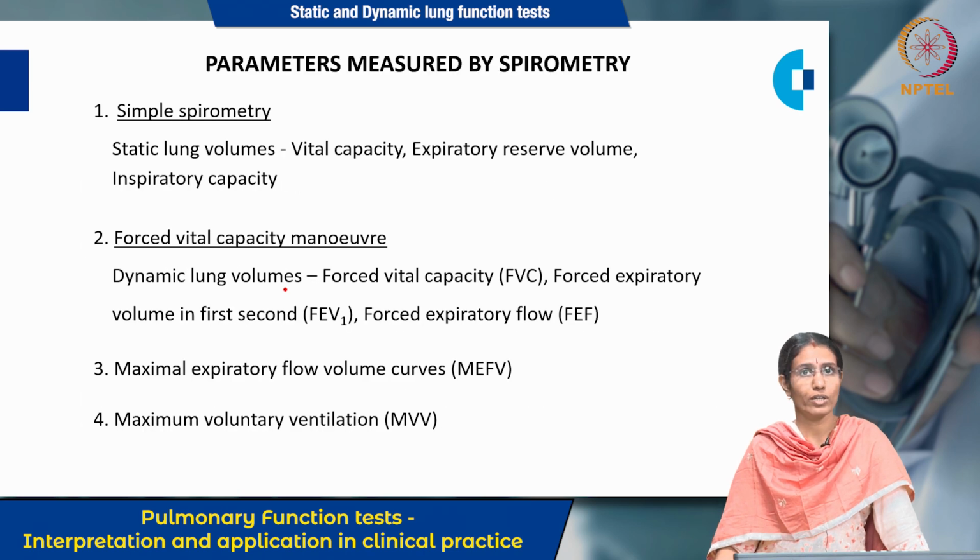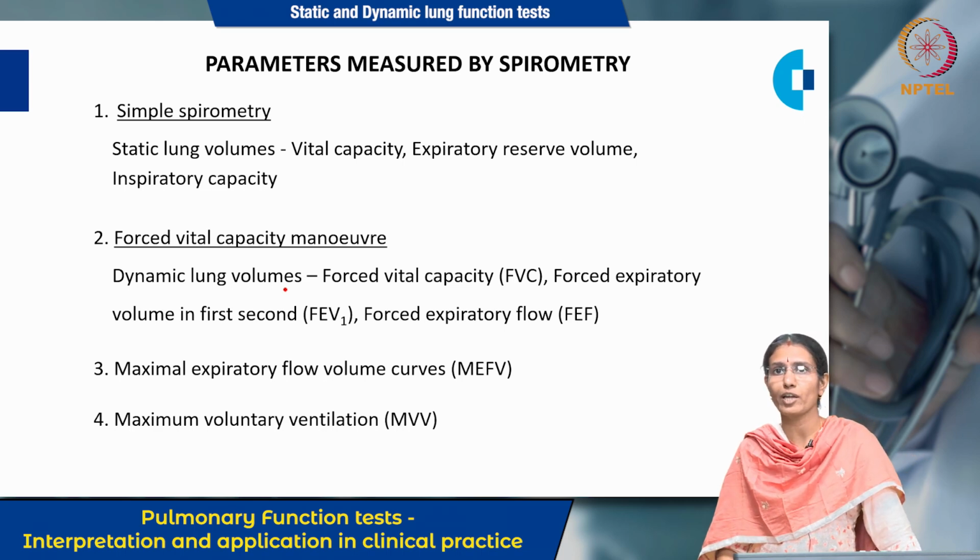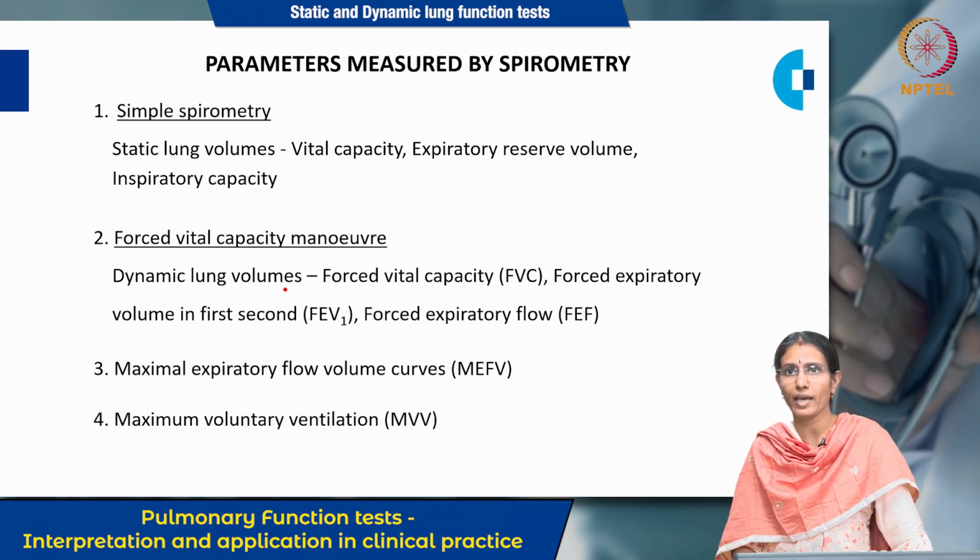So we have seen the different parameters in this module, measured using the spirometry technique. What is spirometry? Again, let me repeat. Spirometry is a very important pulmonary function test, which is used widely for diagnostic purposes and research purposes. There are simple spirometry techniques and spirometry using forced vital capacity techniques. We saw static lung volumes, which are measured using simple spirometry, and the dynamic lung volumes, which are measured using the forced vital capacity technique.